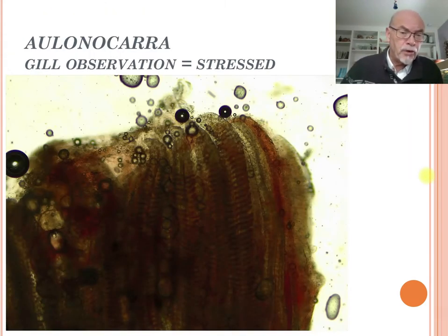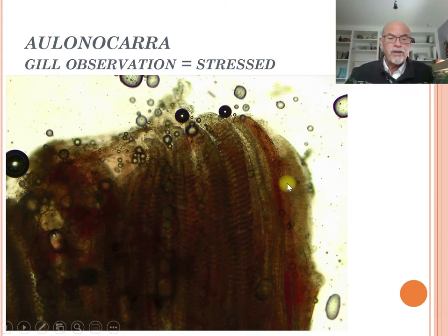But we didn't stop searching after finding this worm on the skin. We also looked at the gills, and we saw that the gills were pretty red. Badly reddish, stressed gills. A lot of slime, some bacterial intrusion here. So healthy gills were not there. The fish were also suffering from a problem in the gills. And this could have been caused by a problem with the inner organs.